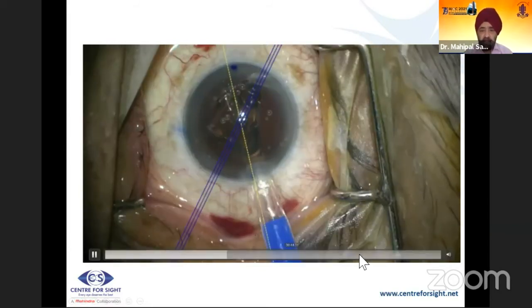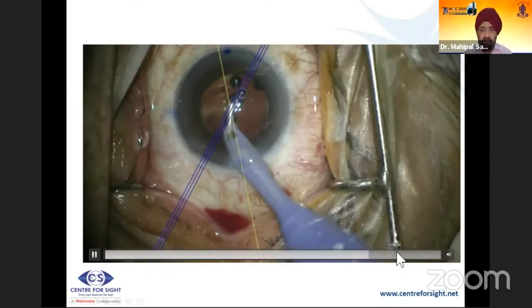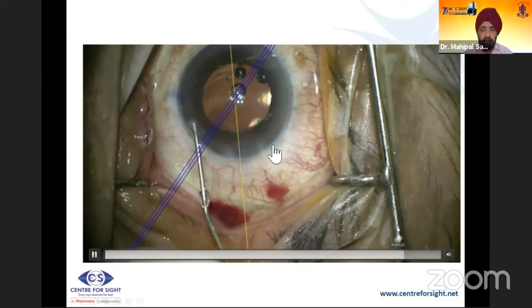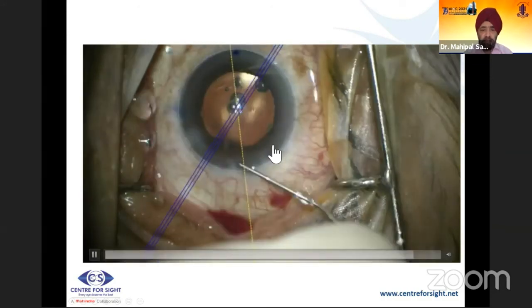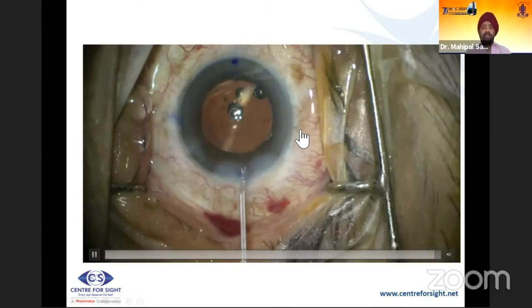So this is the Callisto. This is the markerless system, the IOL 700, that is used. You put hydro. You don't want the chamber to become shallow, because there can be a tilt, and then you can mark the alignment that is there.